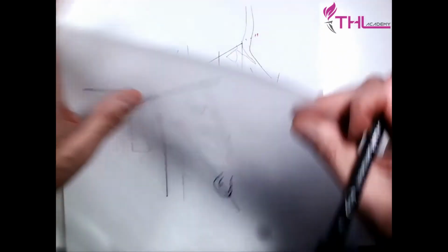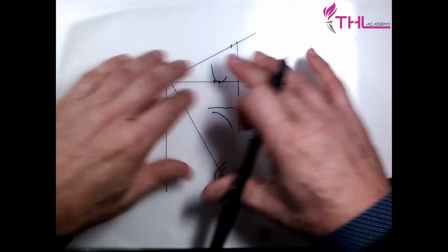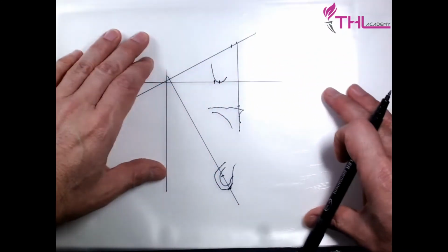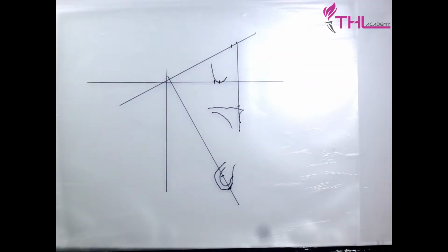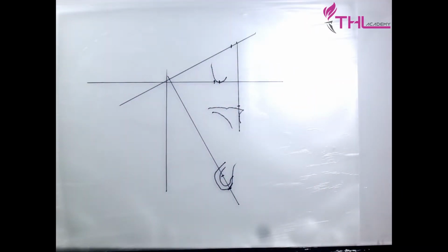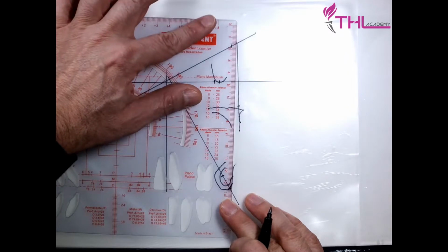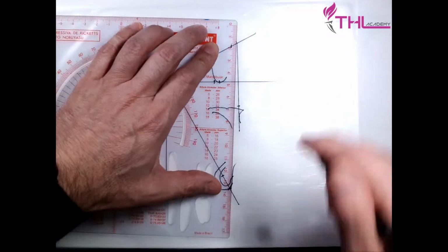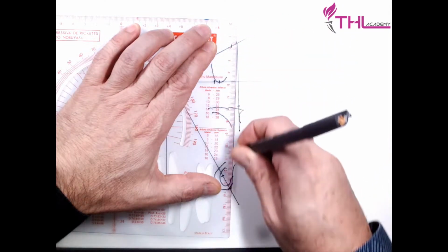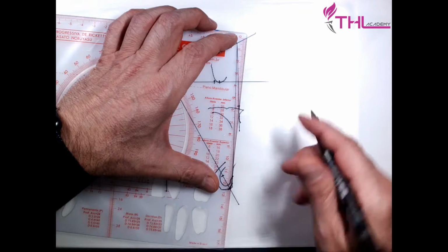Okay, now I can forget this for a while. The orbit moves 0.55. In what direction? Anterior, following the Frankfurt plane. So now I can put a new facial plane and a new suprapogonium line like this.